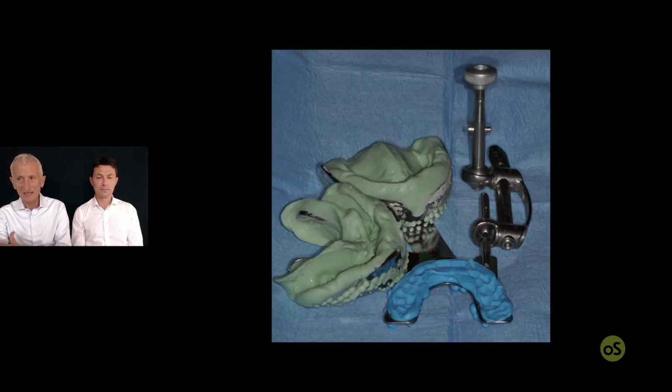Okay, so now let's see one case. The patient comes into the office with some terminal dentition, and we discuss with him. I noticed that the dentition is compromised, but the bone is okay. So I decide that there is no need to open the soft tissue and make any kind of flap, any kind of osteoplasty. So this is going to be a socket fit restoration. So I need a white shell.